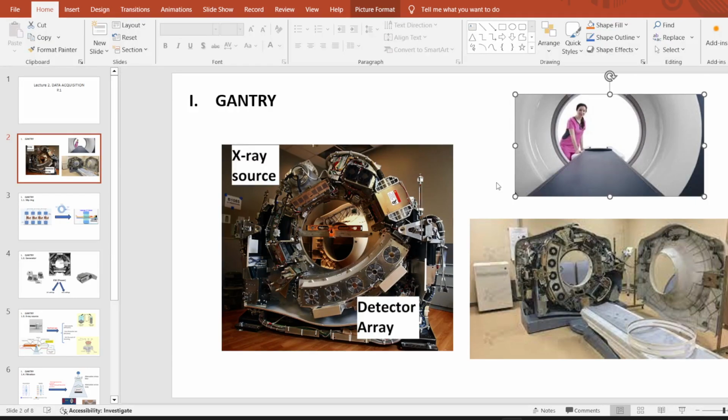All right, I'm back. So, two most important things about the gantry. First of all, the tilt angle. It's a simple thing. You want to change the angle up and down, depending on the patient and the application you want to use on the patient. I just want to mention it in case you saw it in the past in a configuration document of some CT gantry.